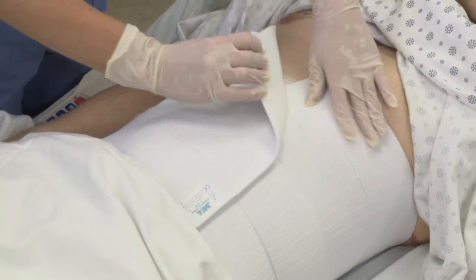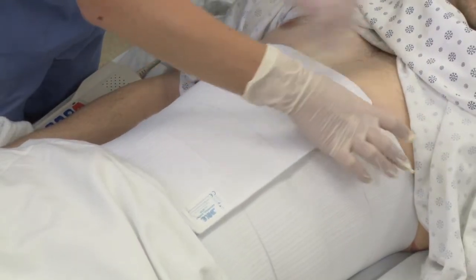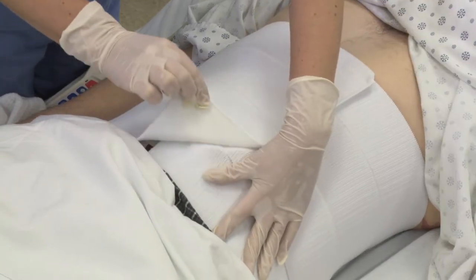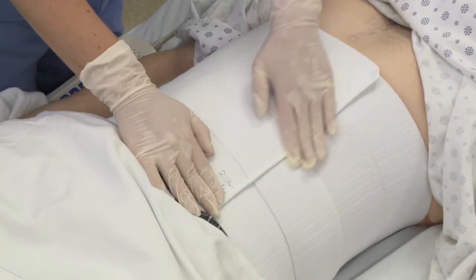To adjust the fit, simply peel the surfaces apart and reposition them. The closure can be diagonally angled to conform to any patient's body shape.